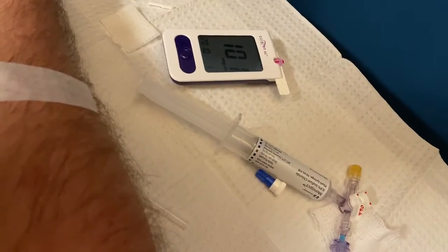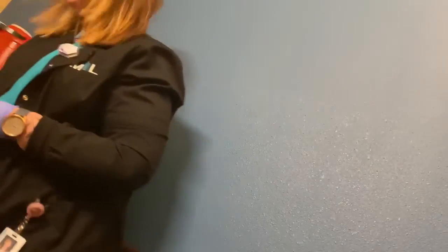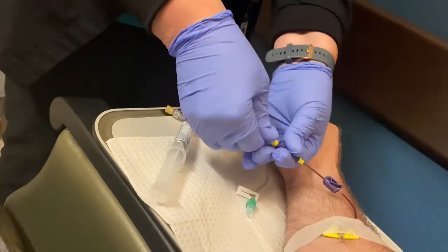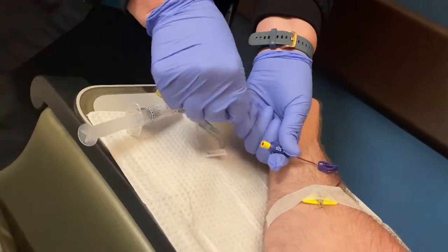It's very important to have normal sugars when getting a PET scan. 101, which is fine. I'm going to have you hold that. If you have too much glucose in your system, we could miss something. It seems pretty important not to eat a bunch of stuff before the PET scan too, right? Absolutely, because that brings up your glucose level. If you've got too much glucose in your system, it could hide cancer, because this all runs off the sugar levels in your system. Pretty dangerous then, right? If you don't follow that, you might miss something on your scan and not get treated for something you need.